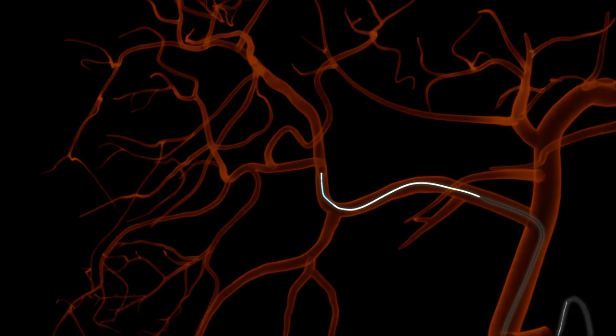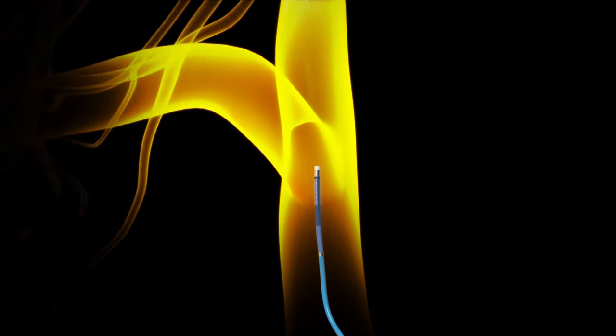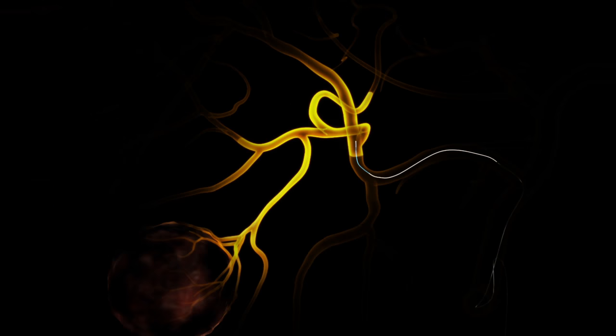The tip may be articulated to the same angle of the vessel branches to help direct the guide wire and Swift Ninja through the vasculature.